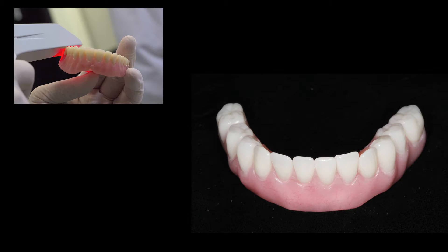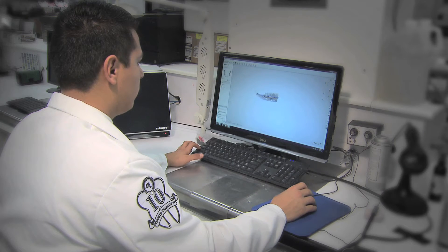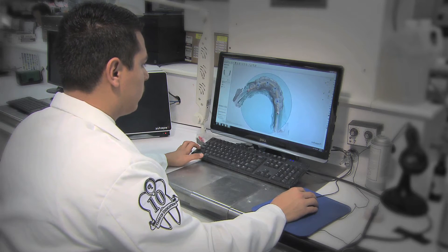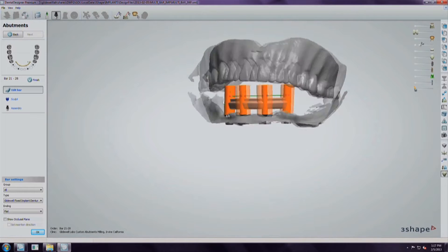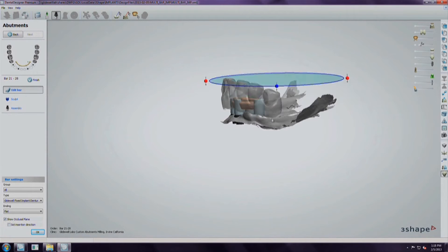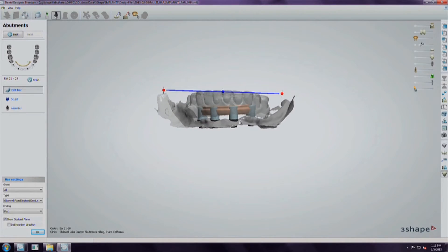With sufficient primary stability, the patient could receive a fixed provisional at the time of surgery, providing a stable lower denture. The provisional denture would be designed in dental CAD using the setup from the existing denture. The final restoration would also be produced digitally, beginning with the CAD-CAM provisional design and incorporating any adjustments made to the provisional post-surgery.